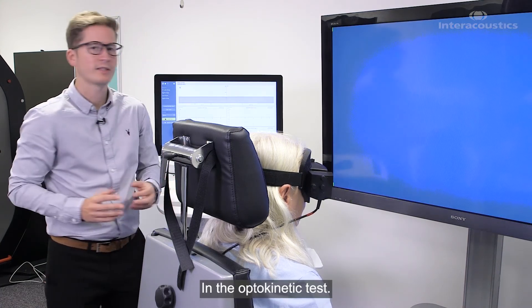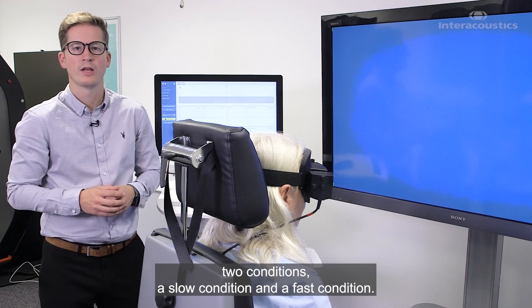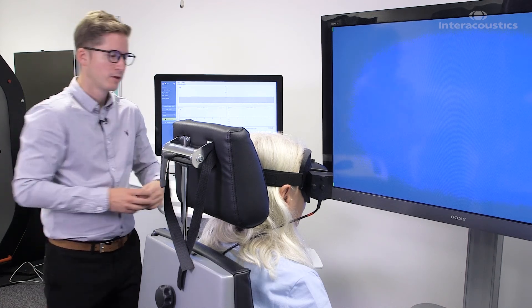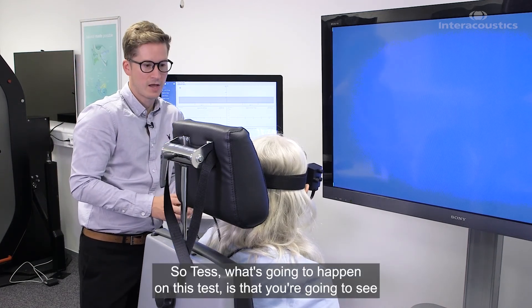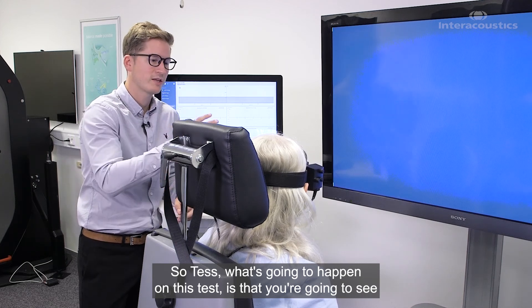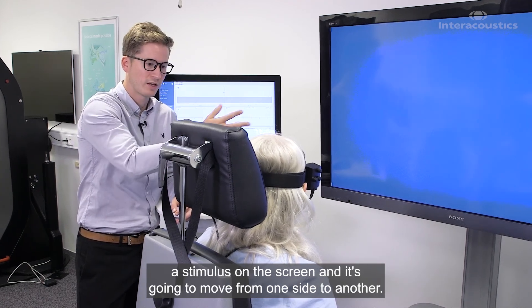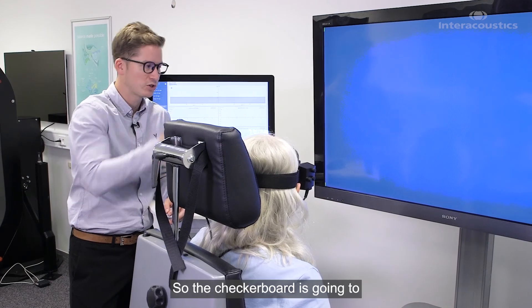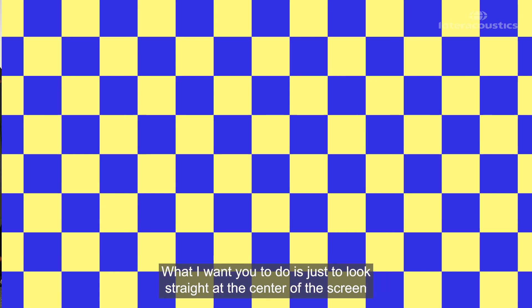In the optokinetic test, we're going to test two conditions: a slow condition and a fast condition. What's going to happen is that you'll see a stimulus on the screen moving from one side to another — the checkerboard will move either from left to right or right to left. Just look straight at the center of the screen and watch the pattern pass by.